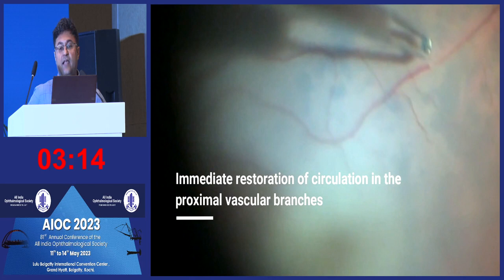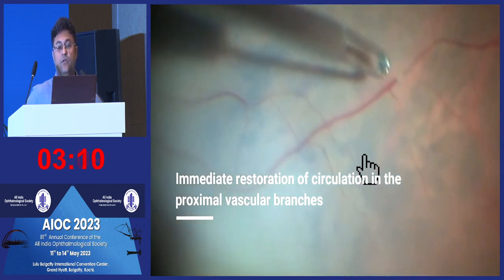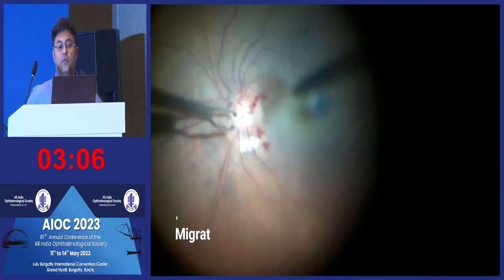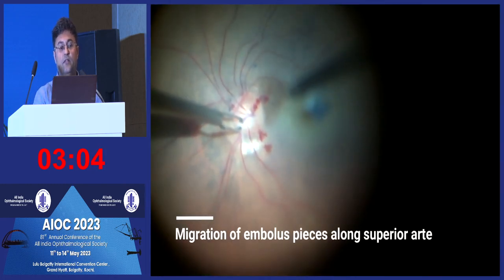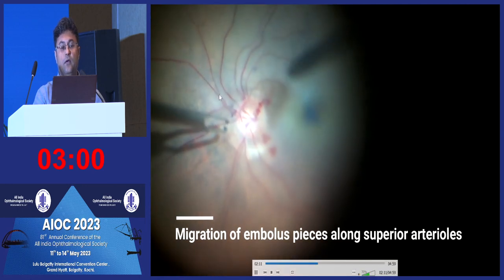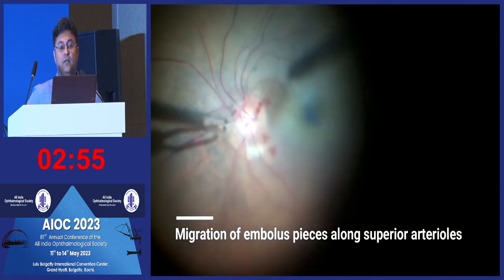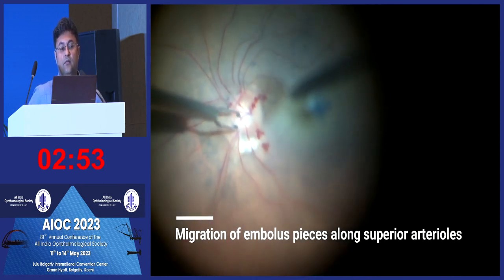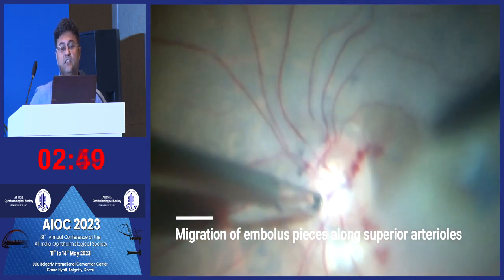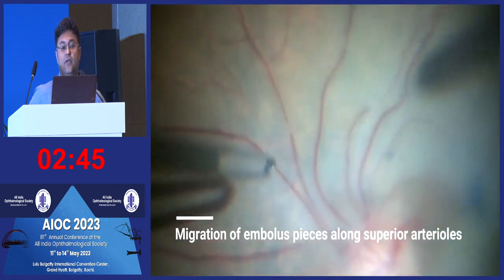And as we see the embolus migrating along the artery, we see that the circulation is coming in right through there and the retina getting perfused on table. So the same thing happens with the other two sets of emboli here. You see them migrating along two other arterioles and the circulation coming in right there. Again, I'm going to rewind that. So if you see, in high magnification, what I've done is just nudge the artery a little bit gently, so to say, and dislodge the embolus from there.